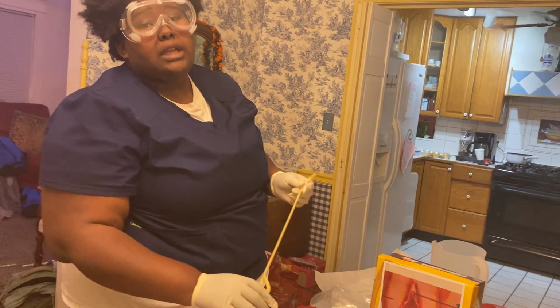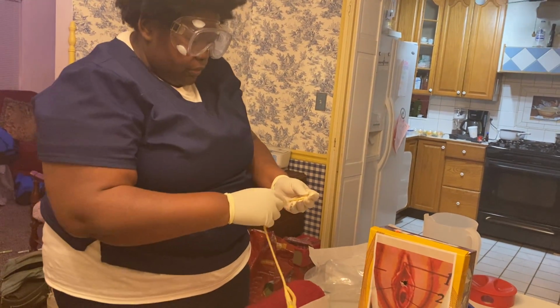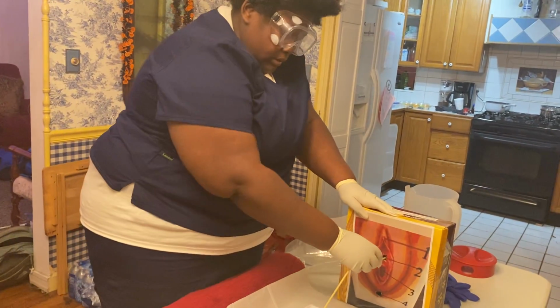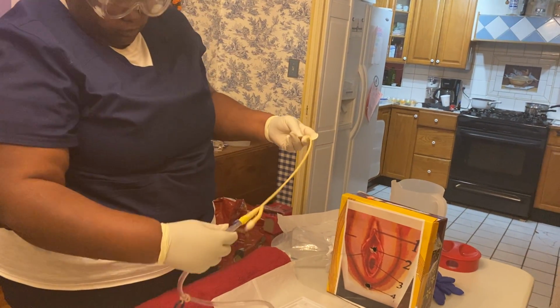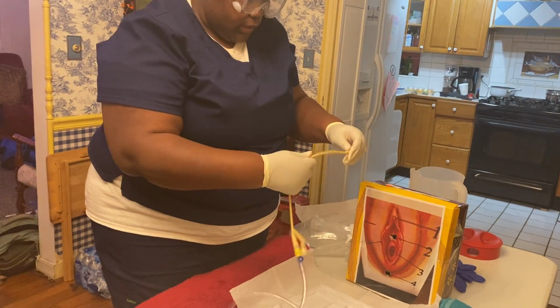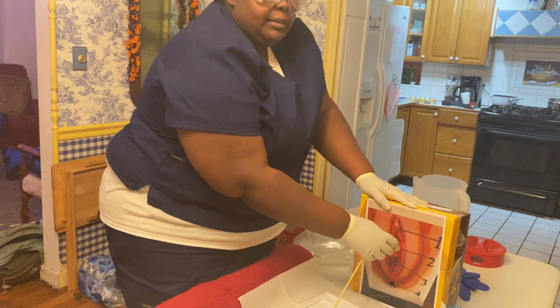Then I will explain the procedure to the patient and tell them I'm ready to begin. I will dip this in the lube like I already did, and I will slowly insert it with my dominant hand, while my non-dominant hand holds it open.